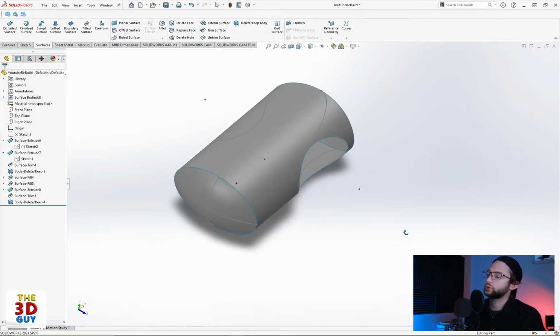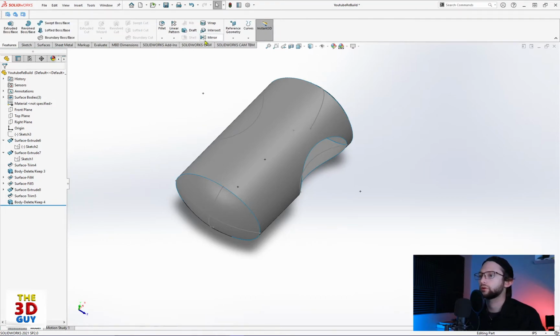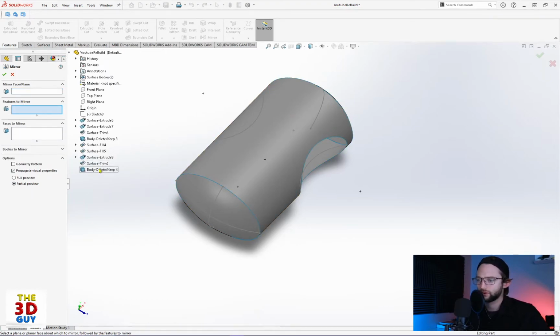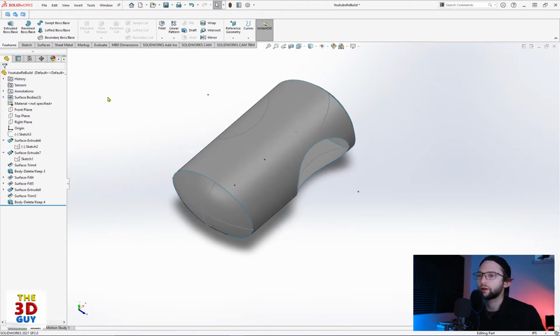And we're actually just going to, let's try mirroring it. I'm not sure if the feature will go across, since there are multiple steps, but we can give it a go. We'll click on that one. Yeah, it won't really like me doing it. Come on. Yeah, with multiple features in this case, it won't work. That's all right, we'll just do the same thing.